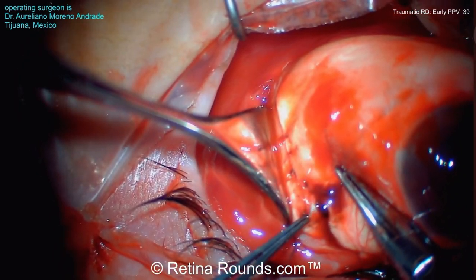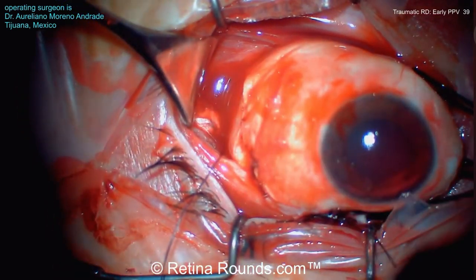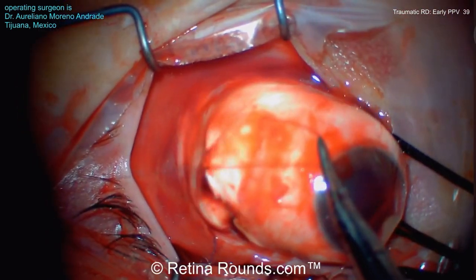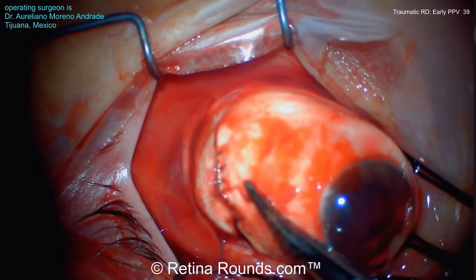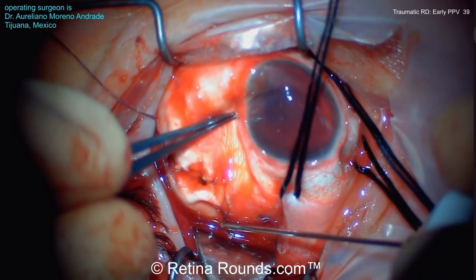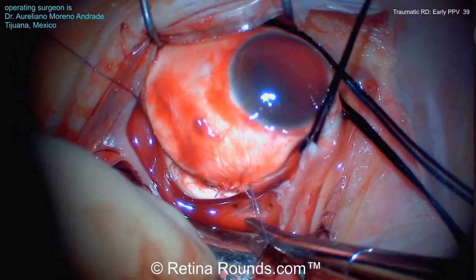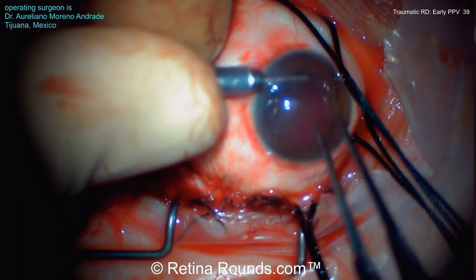Now, using simple interrupted sutures to close this wound, starting centrally and working out in both directions towards the lateral aspects of the ruptured globe site. Looks like in this case he's using a Vicryl suture, which is a braided suture. My general preference is to use a monofilament suture just to decrease the risk of dragging any uveal tissue or vitreous, but that's based on surgeon preference.